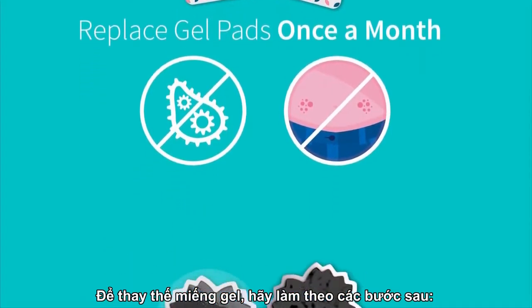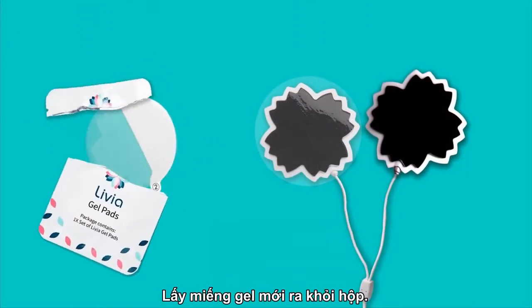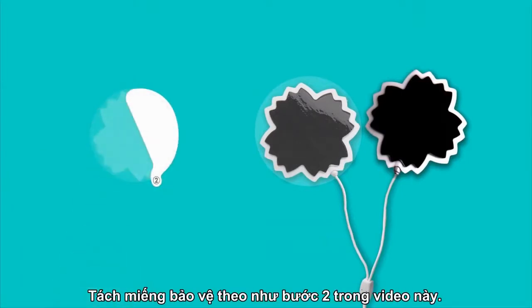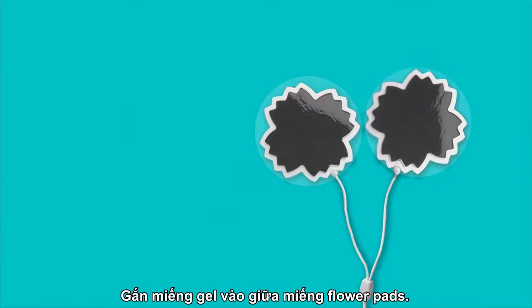To replace the gel pad, follow these steps: peel off the used gel pad, take a new gel pad from the kit, peel the protector in two steps as shown in the video, and attach the gel pad to the center of the flower pad.